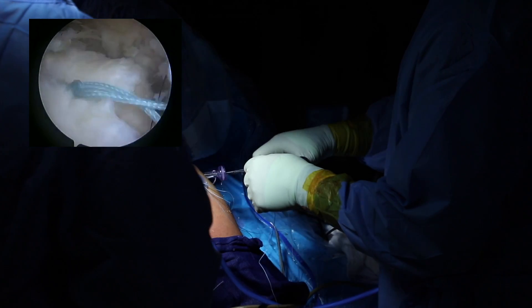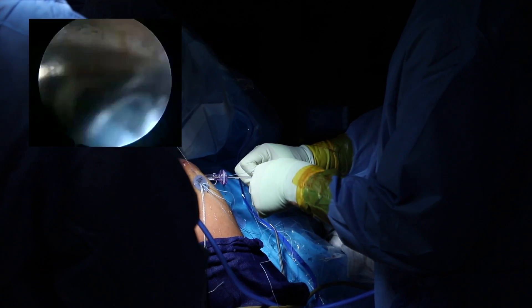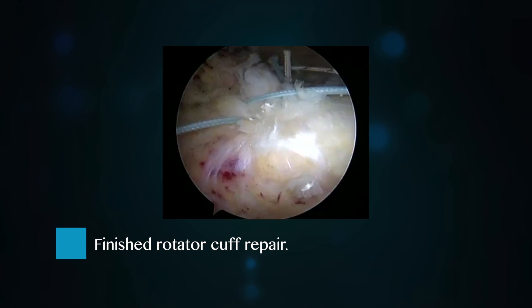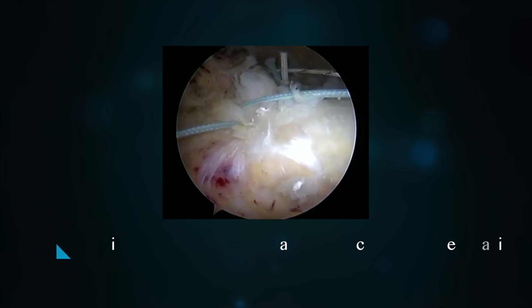You fix the rotator cuff like you would typically, and then at the end of that part of the procedure, you add an additional step in which you put a patch over the top of your repair. All rotator cuff surgeries are done arthroscopically, including the allograft augmentation component.